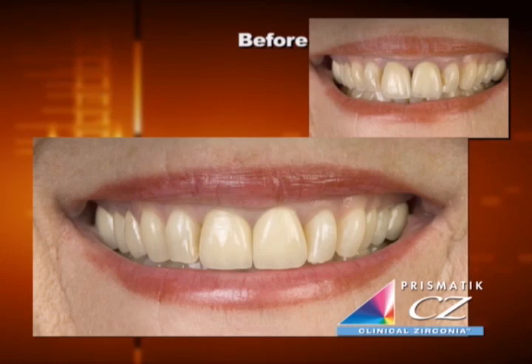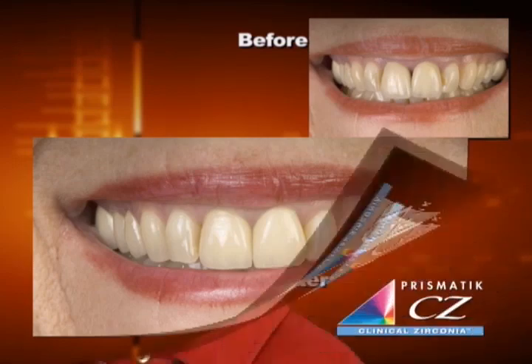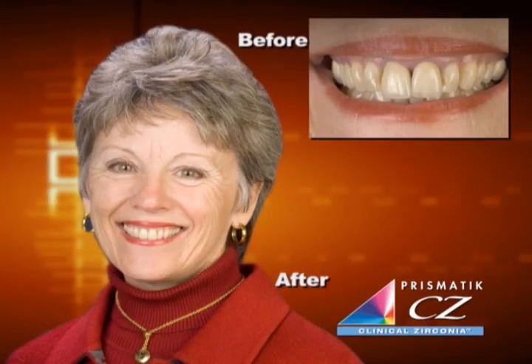And I can't tell you how hard and how big of a lesson that was for me to learn, because it literally took 10 years for me to learn that. But incredibly important, leave that open so the patient can rinse fluids like the tooth and gum tonic back and forth through that gingival embrasure, have the lab make a soft tissue model so they can check that the permanent restorations will close that gap. And then when you actually get the final restorations in place, it should be nice and closed, and you should get the great result that you see here from the clinical zirconia crowns that we seated on teeth number 8 and 9.